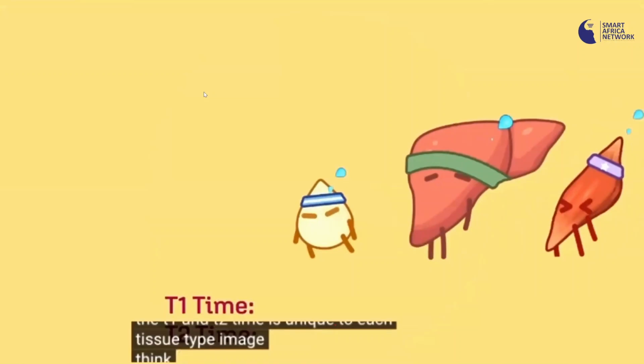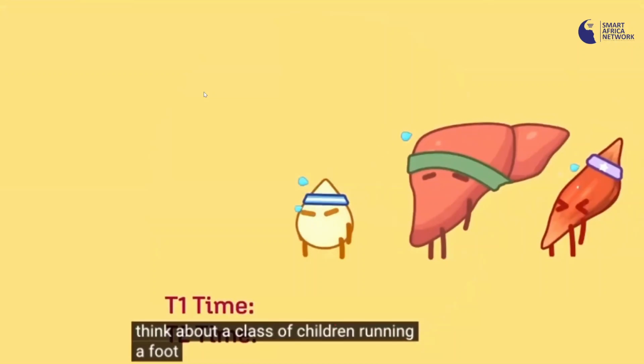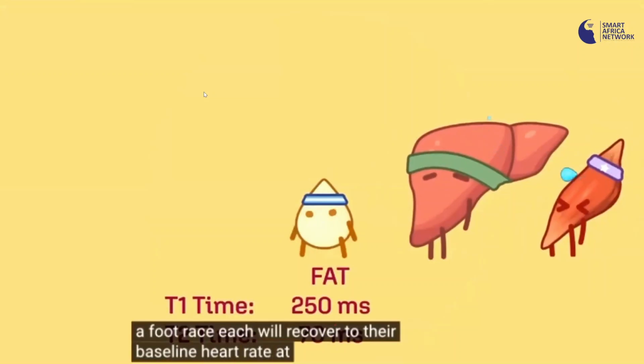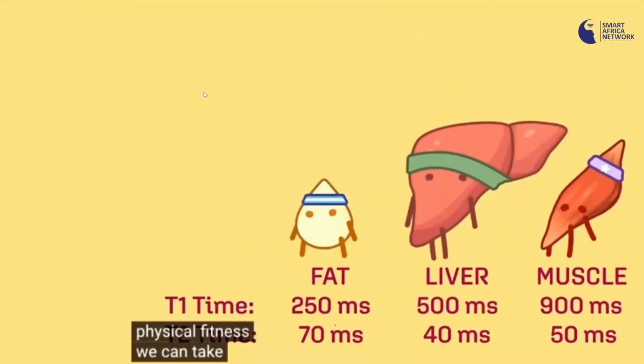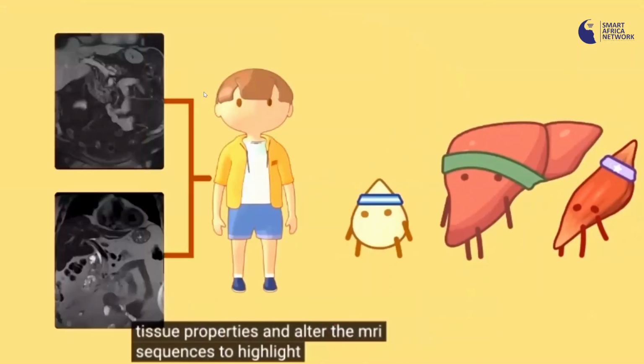Think about a class of children running a foot race. Each will recover to their baseline heart rate at a slightly different time, depending on their physical fitness. We can take advantage of these unique tissue properties and alter the MRI sequences to highlight them. This is called weighting, and discussion of this is for another time.